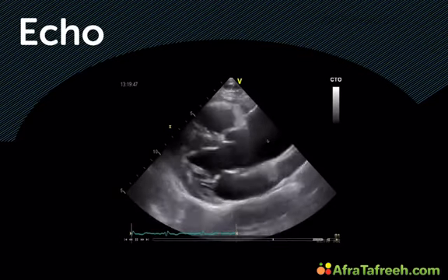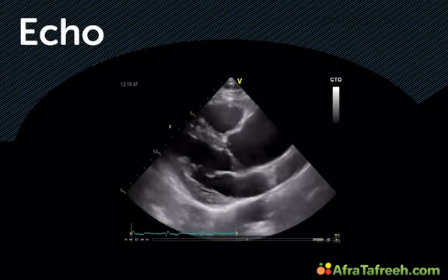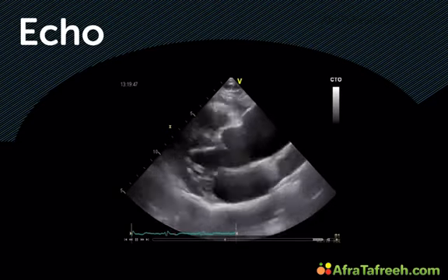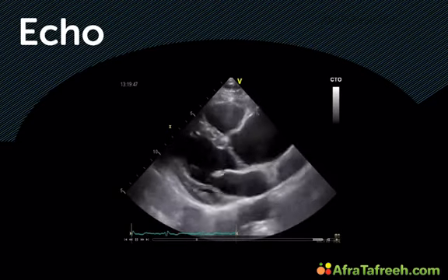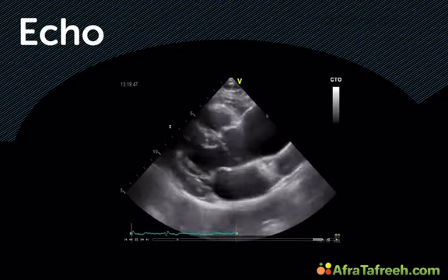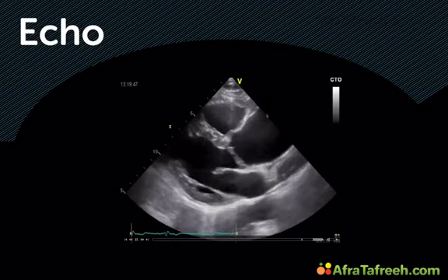Here is a patient, again, with a dilated aorta. In this case, the root is not so much dilated. You still have the sinotubular indentation here, but the ascending aorta is dilated. In this case, it was, I think, in the range of maybe also 5 centimeters.